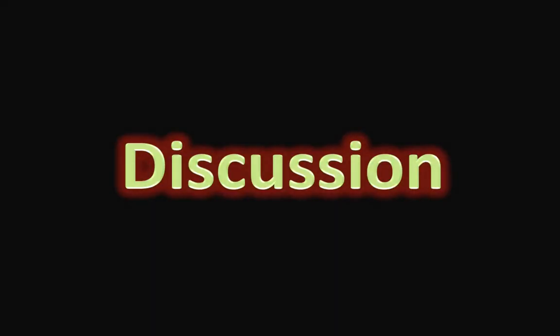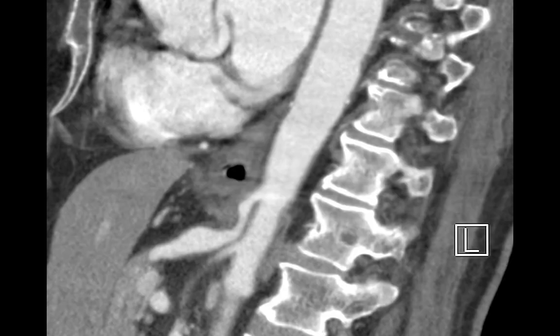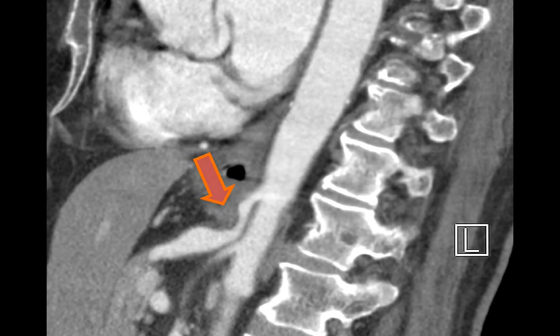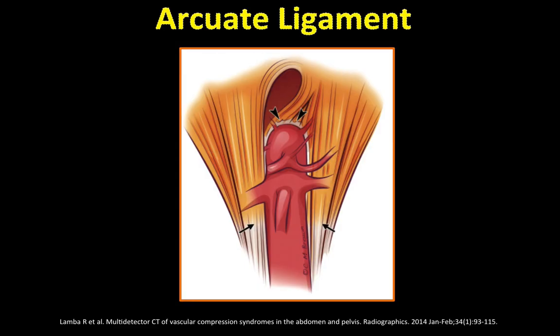Now let's discuss this finding. What is it that has soft tissue density and crosses on top of the proximal portion of the celiac artery from one side to the other? This actually represents what is called the median arcuate ligament, which is a ligament that connects the right and left diaphragmatic crura, and usually connects the crura at a higher level than the origin of the celiac artery.